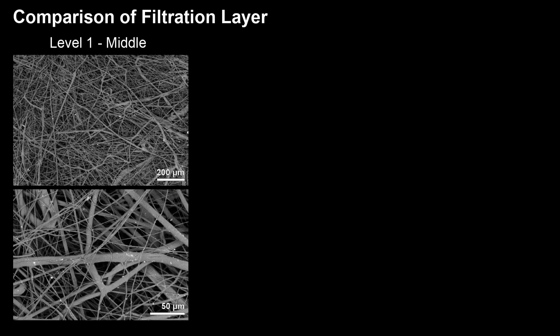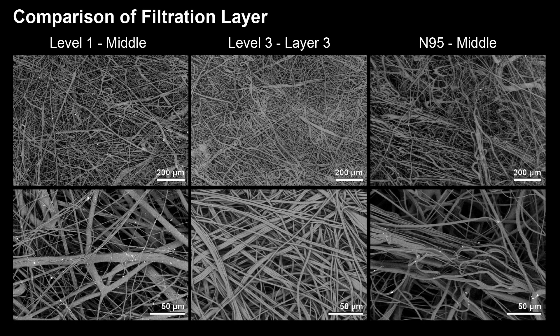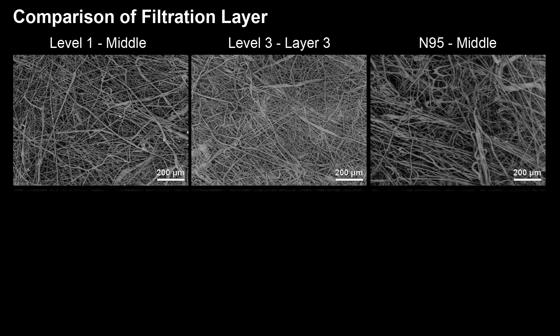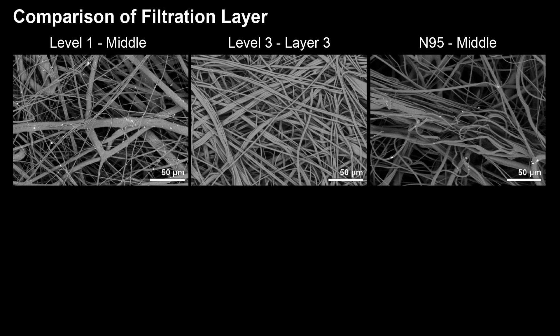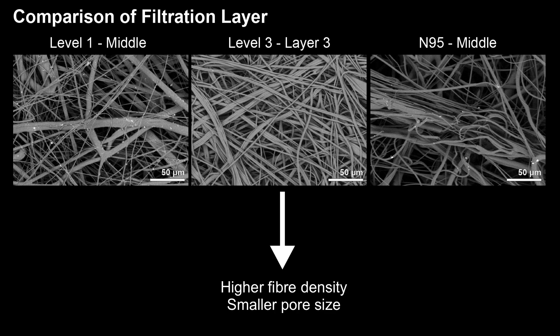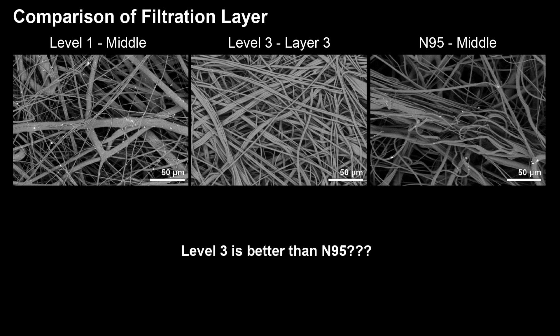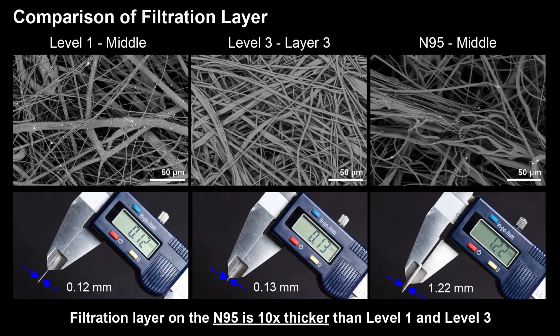After looking at these three masks and respirators in great detail, let's compare the filtration layers directly. Here we have a side-by-side comparison of the scanning electron microscopy images of the filtration layer. The top row contains low magnification images and the bottom row contains high magnification images. At high magnification, the filtration layer of the level 3 mask seems to have higher fiber density and smaller pore size than the level 1 and N95. However, the filtration layer of the N95 respirator is about 10 times thicker than the counterpart in level 1 and level 3. Although the fiber density may be lower on the N95, particles would have a harder time penetrating through the much thicker filtration layer.